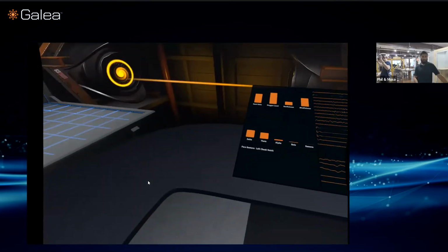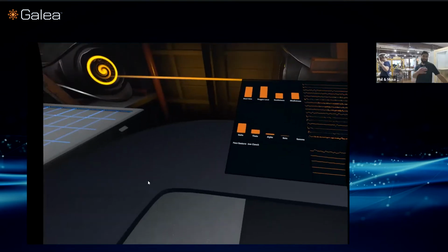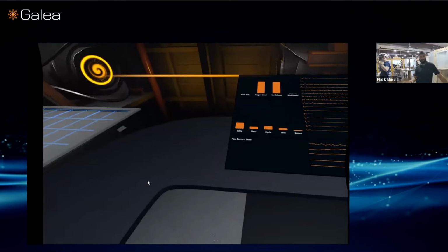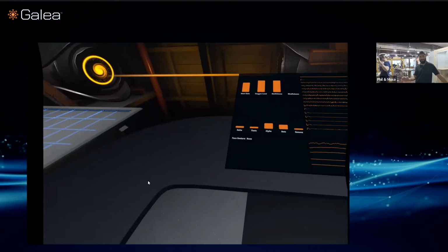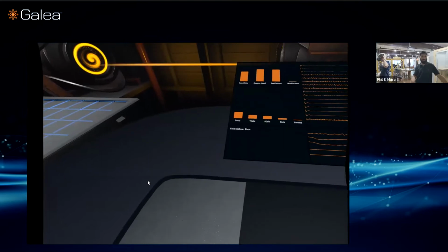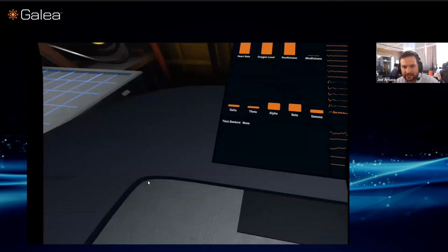And this time I'll prove I'm not using my controllers. As he's moving his mouth, it's jumping between these different features. I'll give him some prompts again, and he will follow through, and you'll see not only the accuracy of the classification, but also the speed of the response. It's a little tough to read the face gesture text.